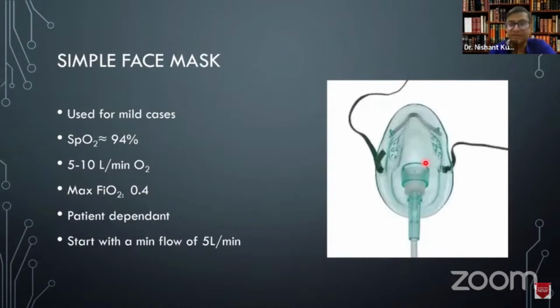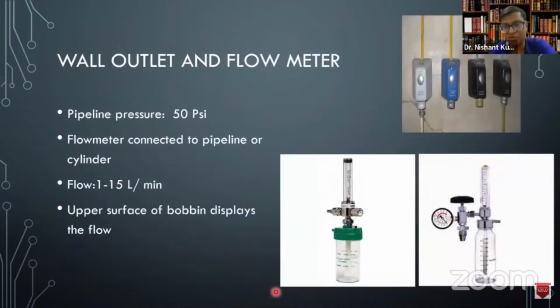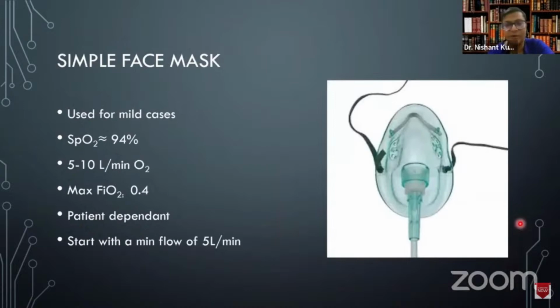Now, with these simple devices that I'm talking about, always administer humidified oxygen. Dry oxygen is uncomfortable. If I can show here, this is the bottle which is filled with water, and oxygen bubbles through this water and is then delivered to the patient. So please remember to use humidified oxygen. Don't use dry oxygen.